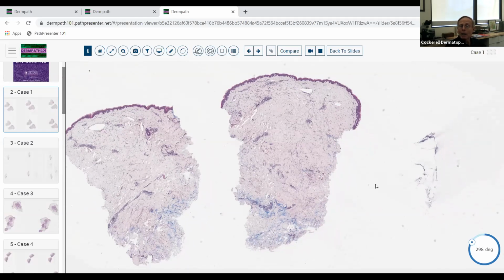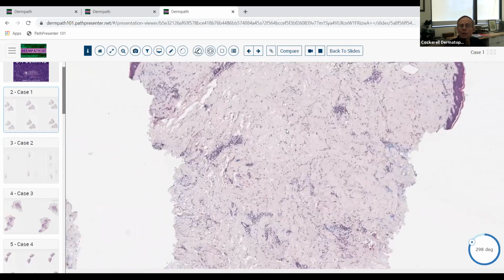So here we have a punch biopsy, and we see it's of an inflammatory disease. There's really no neoplastic anything in here. At low magnification, you can see it's got this superficial and deep, perivascular, but also largely interstitial pattern. And if you look at the shape of the biopsy, here we have two different pieces of it. You can see it does have this almost boxy, squared-off morphology to it. So at low power, you say, well, there are some dark cells here. There are probably going to be some lymphocytes in there, and we've got a higher magnification.